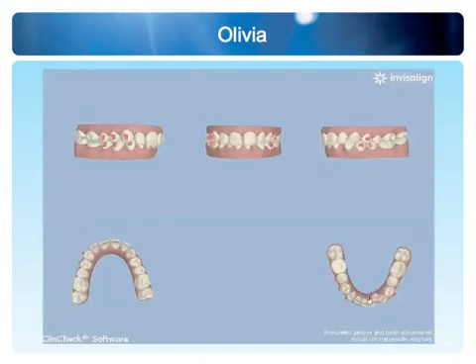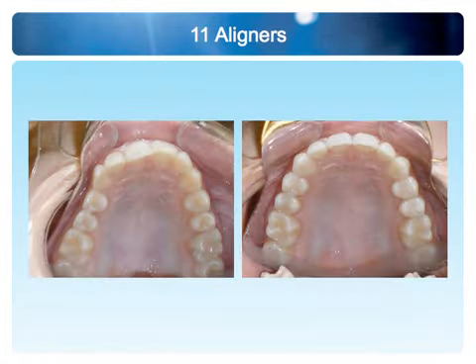And so when the lower follows it, that means that this lower incisor should be able to go into position as the arch is being developed. So, if we applied all those secrets that I gave you to Olivia, it becomes a very routine case, not a complicated case. It is aligner-only therapy, and now I'm going to show you the result at 11 aligners.